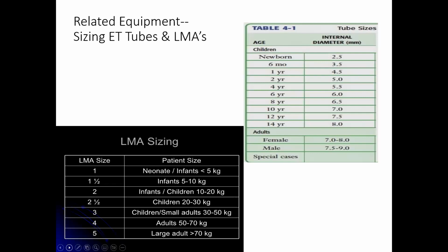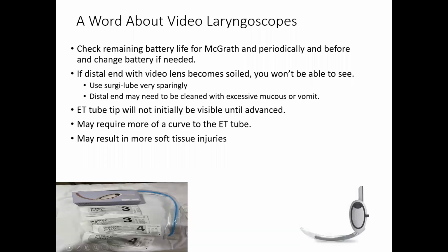I think there'll be a question related to that on there. Award about a video laryngoscope. They're becoming the standard of care. That's the good news. And they're really good.